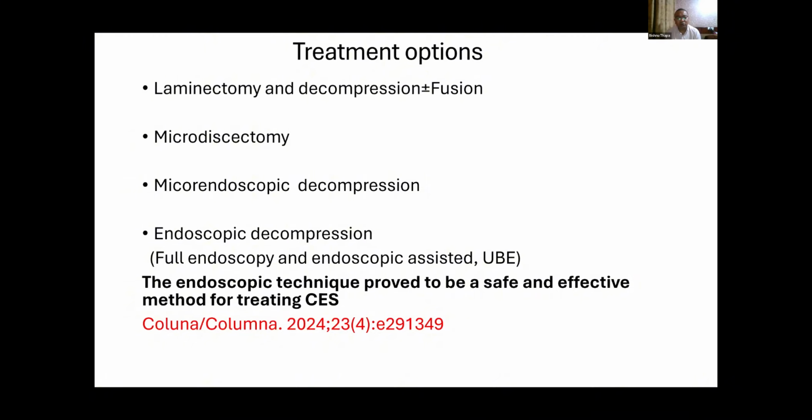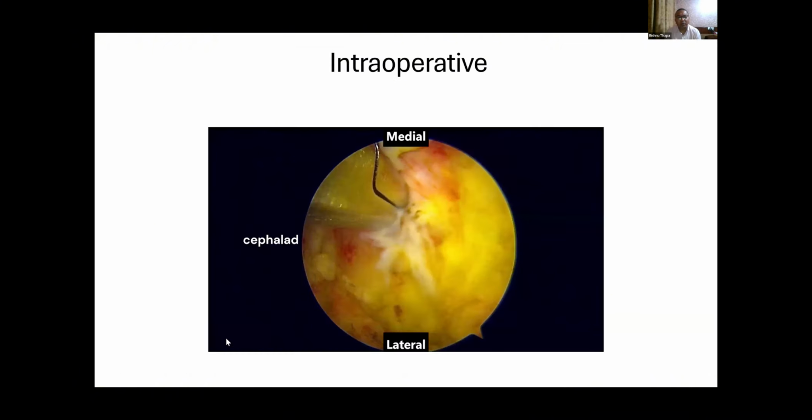So nowadays, due to the development of the endoscope and other instruments, surgeons are gradually shifting towards endoscopic decompression. Though there is some controversy, some surgeons prefer endoscopic and some do not, because of inadequate decompression and some neurological damage. But there are many articles that have mentioned that the endoscopic technique proved to be a safe and effective method for treating Cauda Equina syndrome. Next, please.